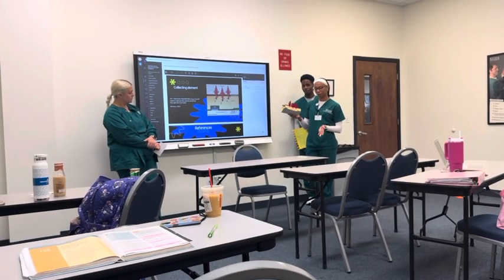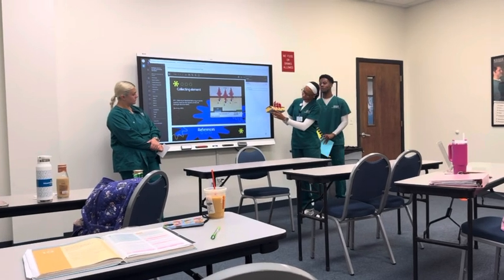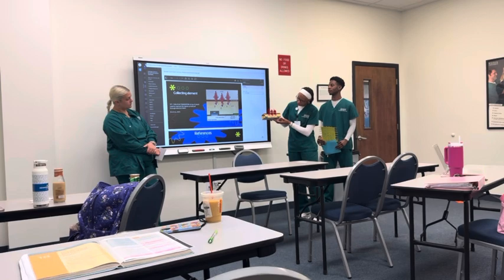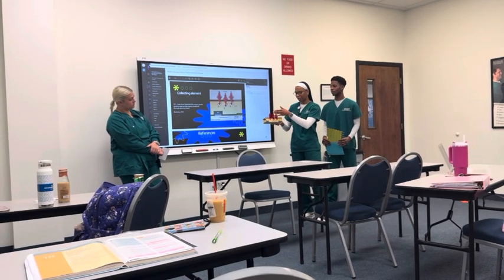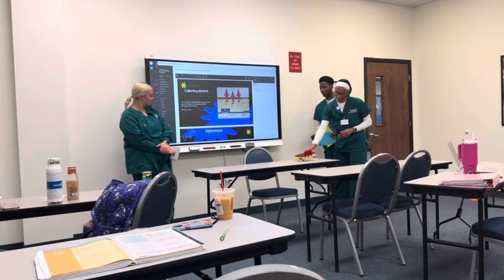But then we have another TFT in a sense. So this is like the TFT. The amorphous selenium is the top part that's red, and then his storage capacitors are here, and this is just supposed to be like the X-ray photons going down through. That's it.